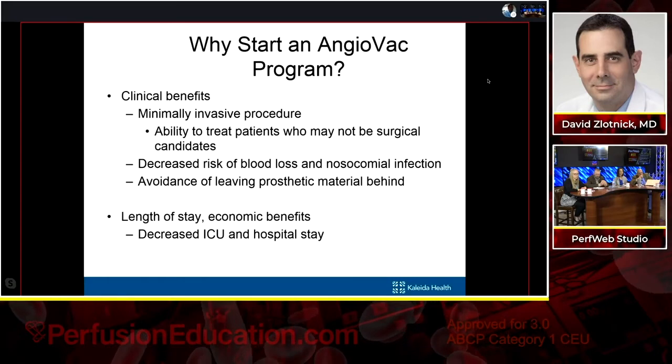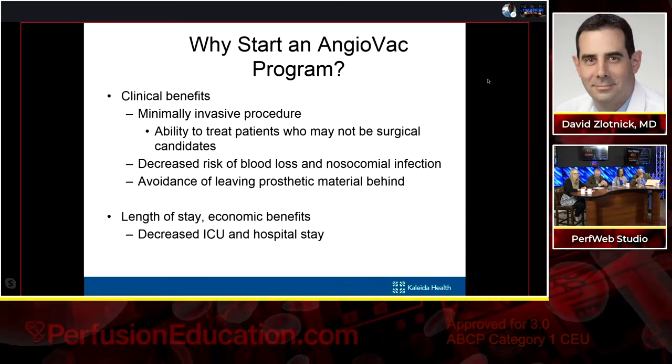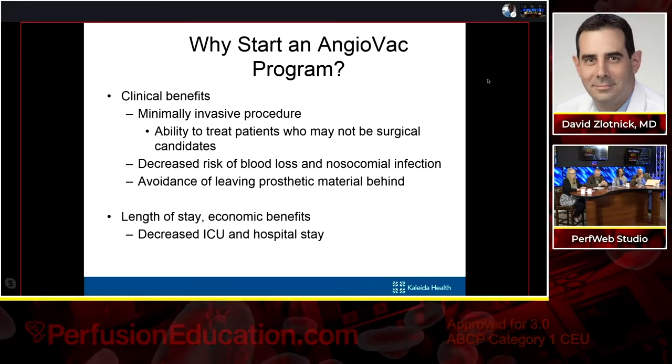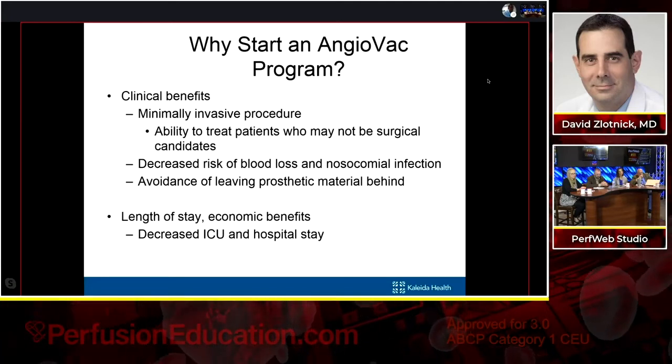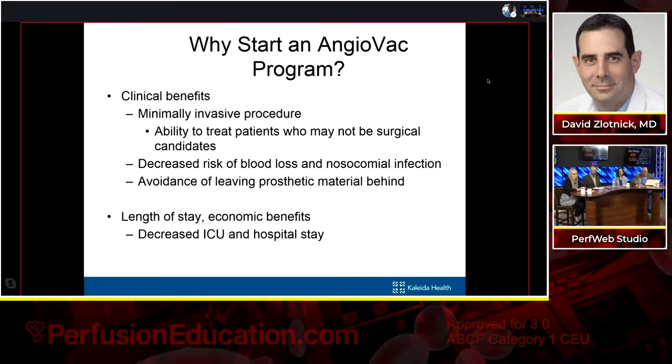So with the last couple minutes that I have, I thought I'd go through why I think programs should think about starting an AngioVac program. One of the clinical benefits is that this is a minimally invasive procedure. It gives us the ability to treat patients who may not be surgical candidates or who may be high risk for surgery. Obviously, we want to decrease the risk of blood loss.